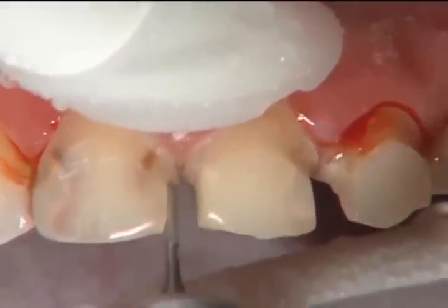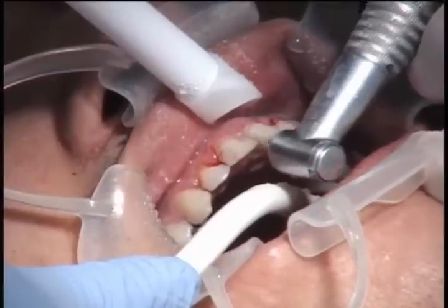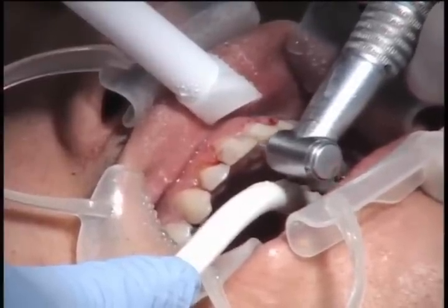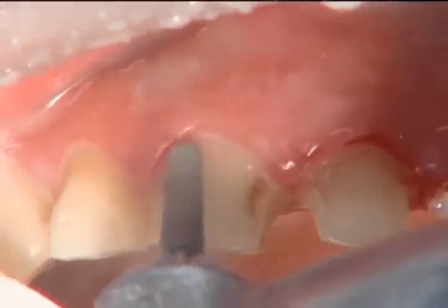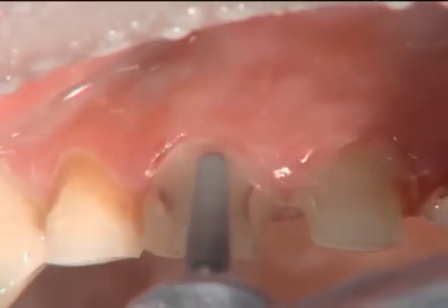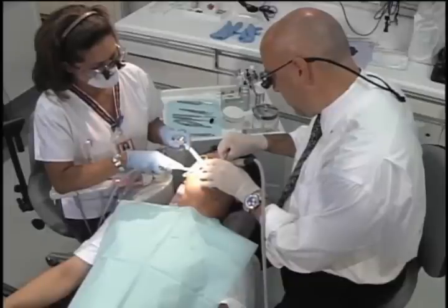We're going to be using the laser to adjust some of the gingival levels, so a little bleeding here isn't a big deal — we're going to cause bleeding anyway when we re-contour the gingiva. Most of the time when we re-contour the gingiva, we will not take final impressions that day. I like to see it heal a little bit and get healthier.